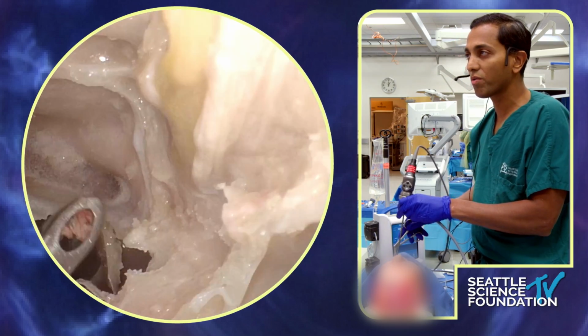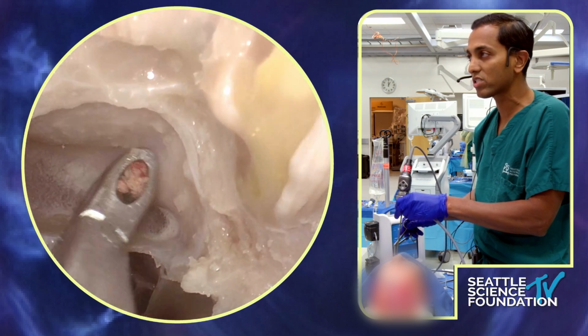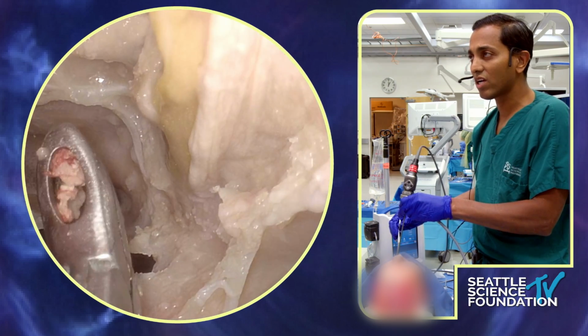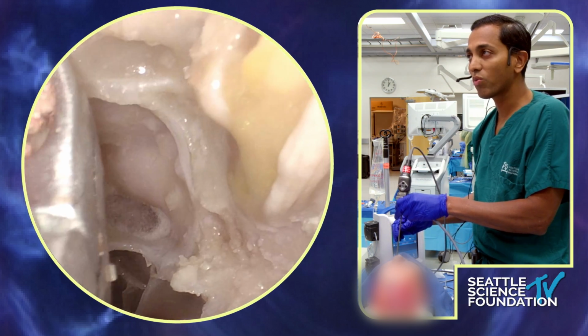So getting all this bone out, but essentially looking at the sphenoid, that we showed. Again, Dr. Sindwani did show that nice optic canal there. And so let's say, joking aside, that you're doing a case and you do get that leak. This is exactly like that video that we showed, right? So what are we looking for here?